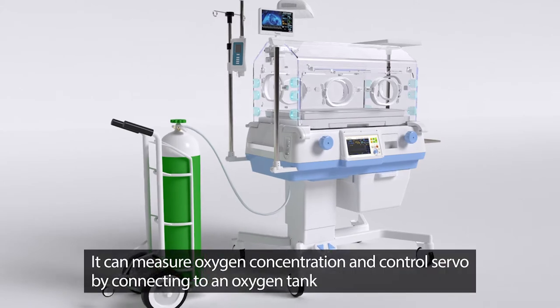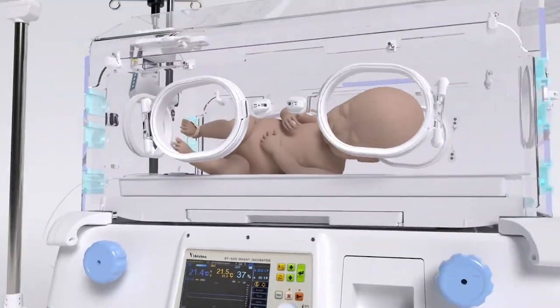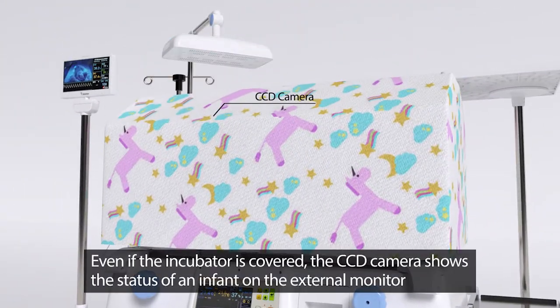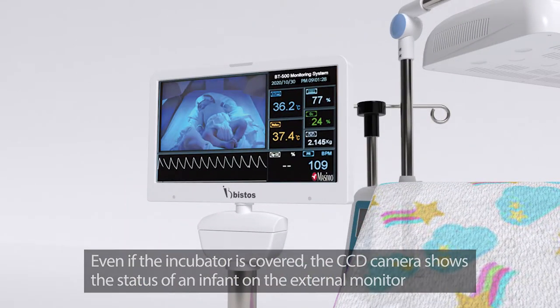It can measure oxygen concentration and control the servo by connecting to an oxygen tank. Even if the incubator is covered, the CCD camera shows the status of an infant on the external monitor.